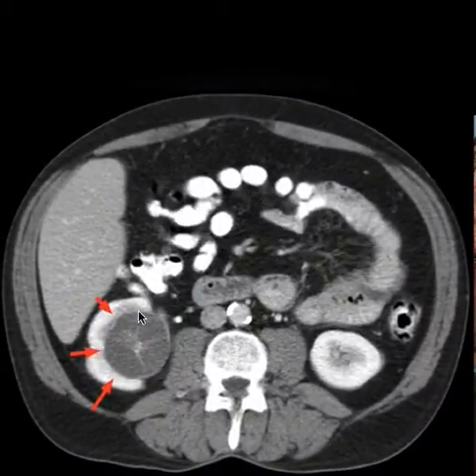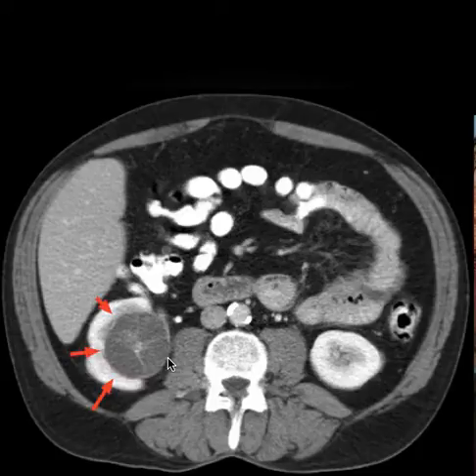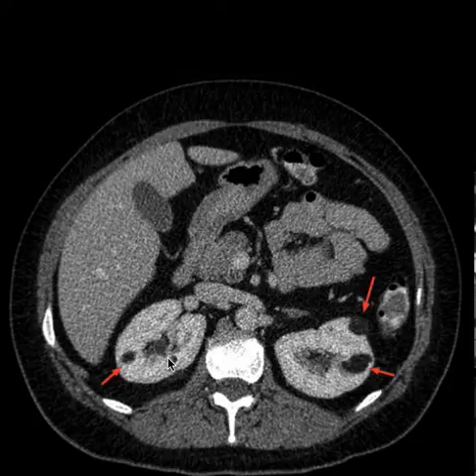Finally, we have another example here. This is going to be an oncocytoma. Although the oncocytoma, we're not able to really distinguish it based on imaging, so most of the time it's still going to come out, although it's a benign lesion. Bear in mind that there's some pathology of renal tumors that are going to be benign, but we're just not able to distinguish them on imaging, so we cannot risk having the patient not undergo surgery. So that diagnosis is confirmed under the microscope as well.